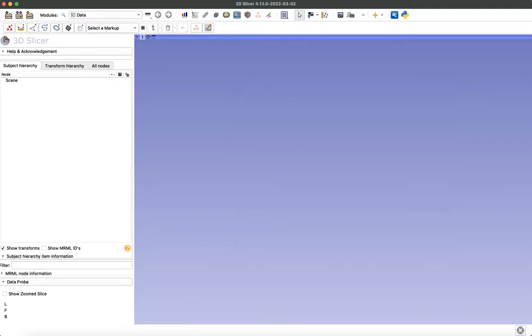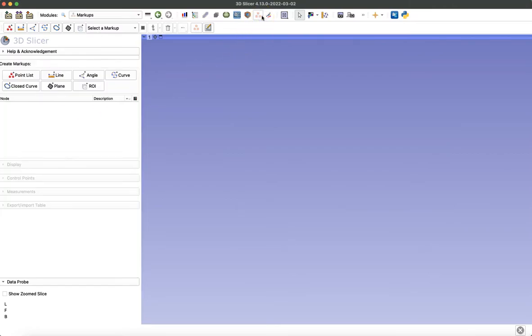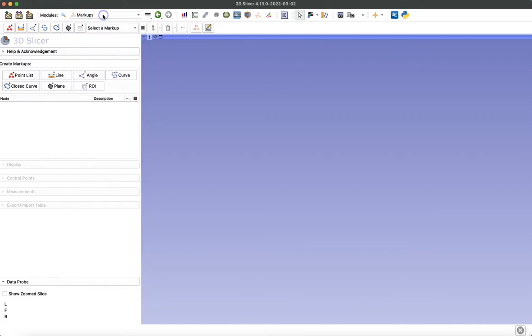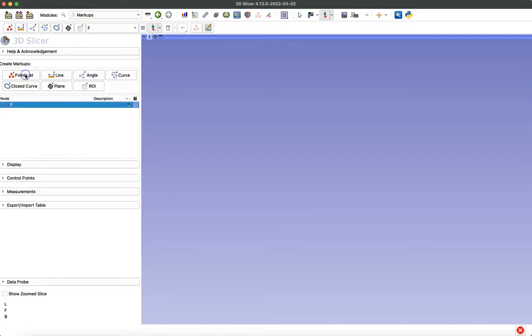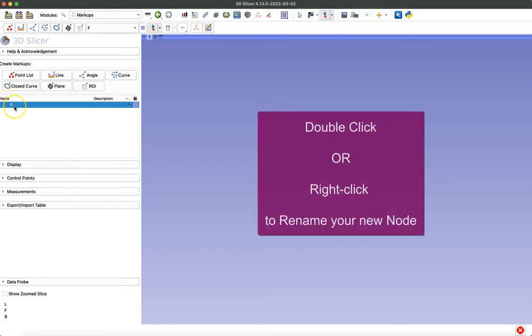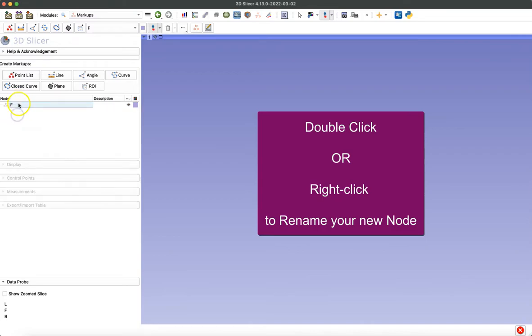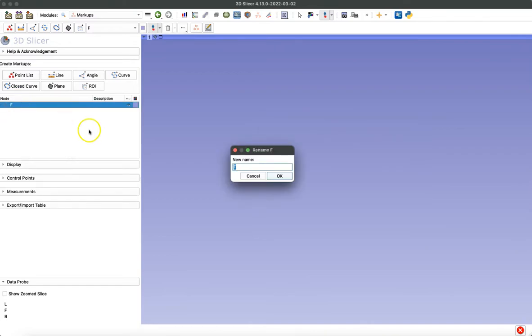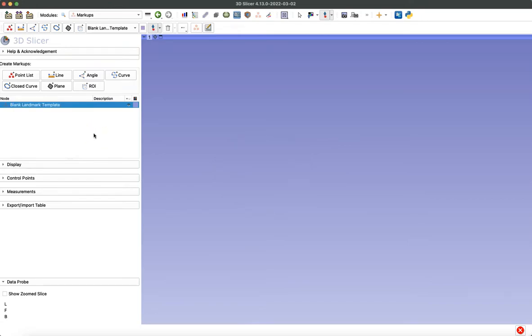We're going to begin by opening the markups module, which you can do by clicking on the icon at the top or by using the drop-down menu on the left. Next, we're going to create a points list and then rename that node. You can do that by either double-clicking or right-clicking, selecting Rename, and then giving it a title. I'm just going to call this blank landmark template and click OK.